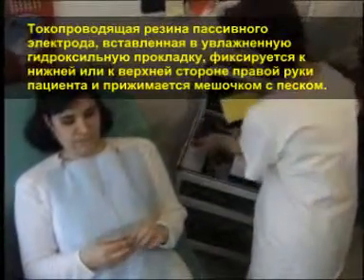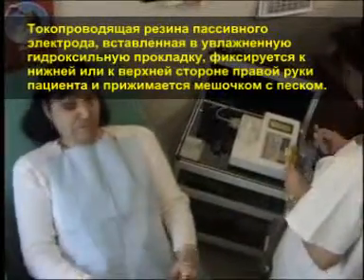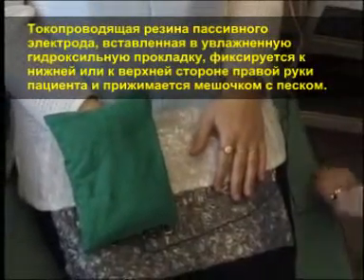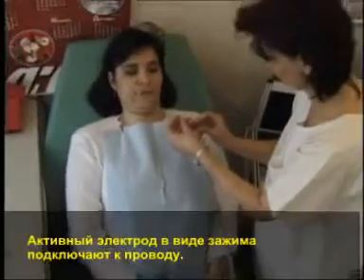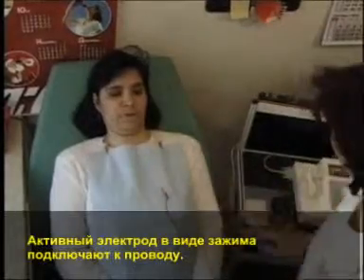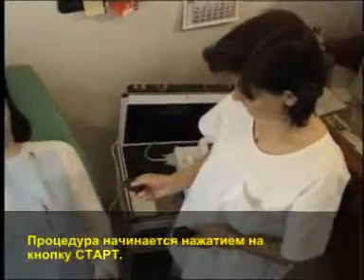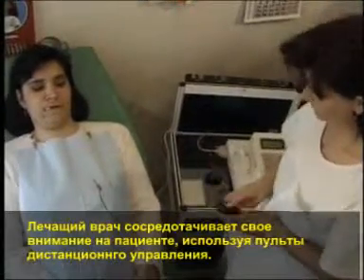The passive electrode, conductive rubber placed in a wet hydrophilic bed, is fixed below or over the patient's right hand and is pressed by a sand pillow. The active electrode clip is switched to the conductor. The procedure starts by pushing the start button. The doctor directs her attention to the patient using the remote control.